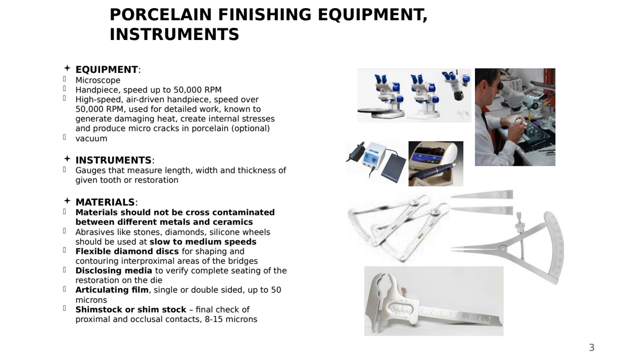I know for Emax and zirconia, it's not recommended to use high speed, especially air driven. If you use high speed with water, maybe it's going to work. I don't recommend it, but if you want to be on the safe side and you need to use it, I will use high speed with water instead of air because, like I said, zirconia is very sensitive to changes in temperature.